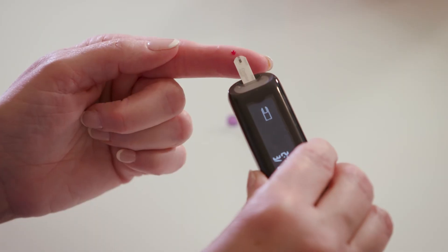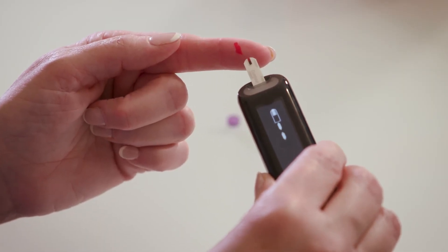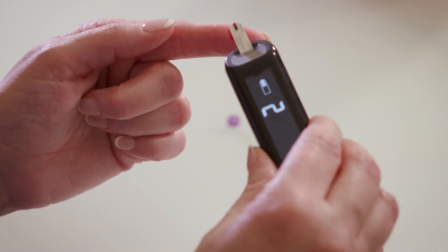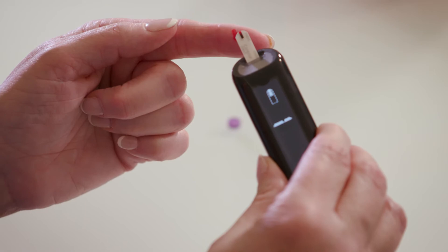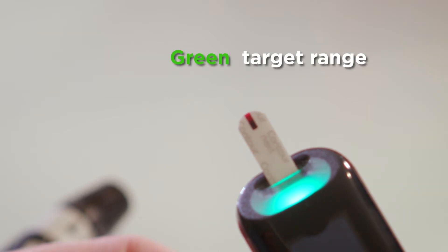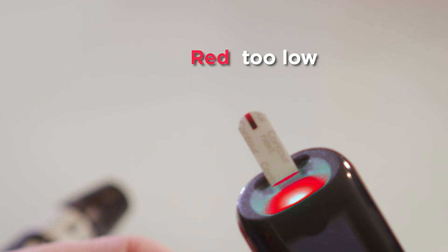When enough blood has been applied to the strip, the meter will beep and count down from five. Then the result will appear on the meter display. You'll also see a color near the test strip: green if your blood sugar level is in your target range, yellow if it's too high, or red if it's too low.